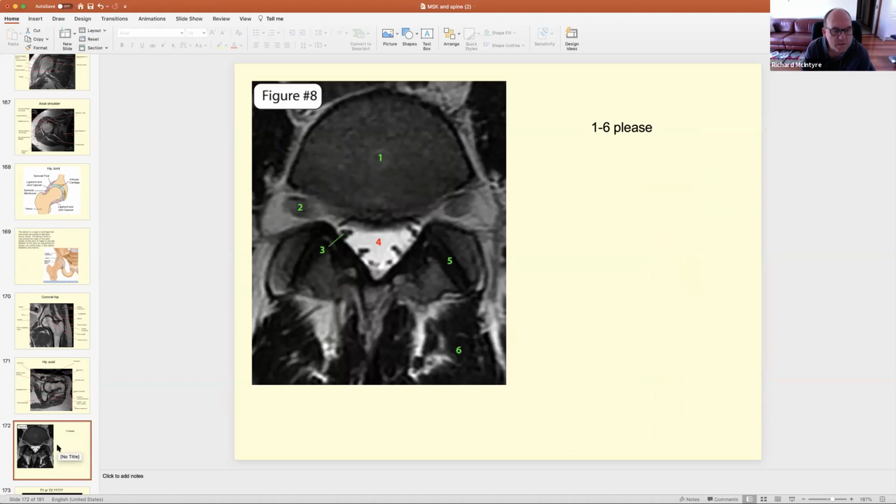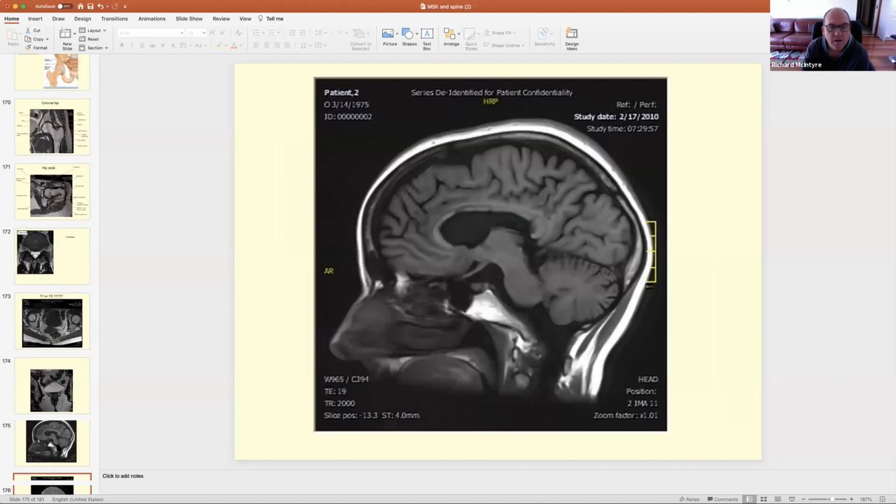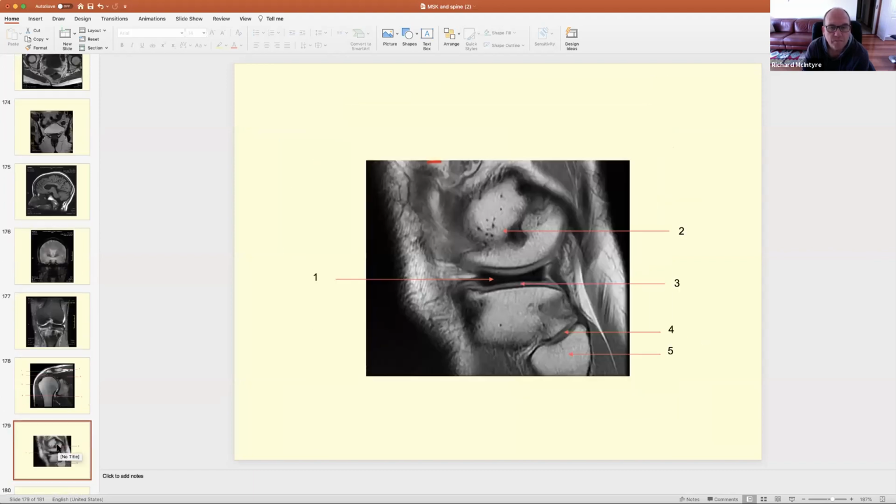And then we've got a little quiz here. You can do the quiz. I will post the answers up in a separate little download on Moodle. Okay, so of course, these are the sort of things you need to identify where you are in the knee, so you know, we can see that's the head of the fibula, the joint with the tibia, and we've got the meniscal bow tie appearance of the meniscus. So it's a lateral or a parasagittal slice through the knee.